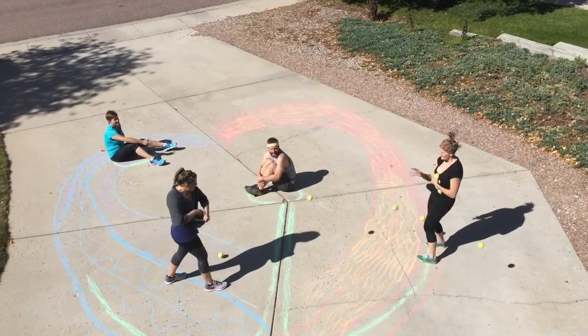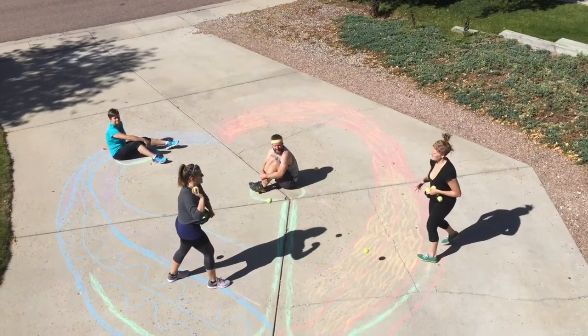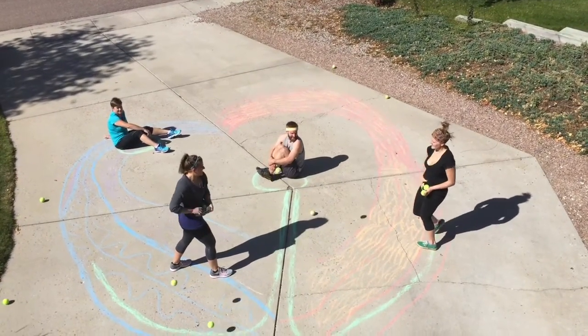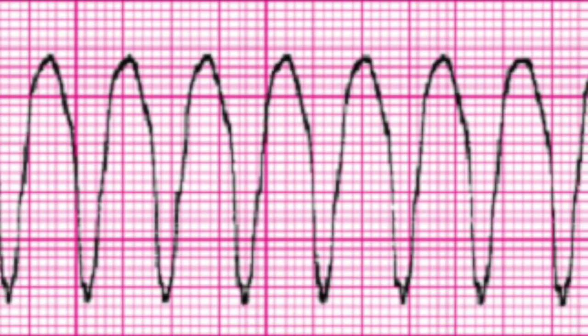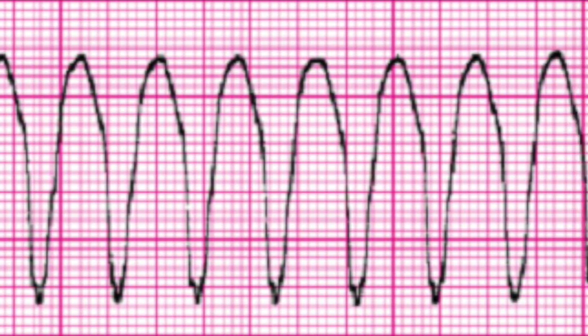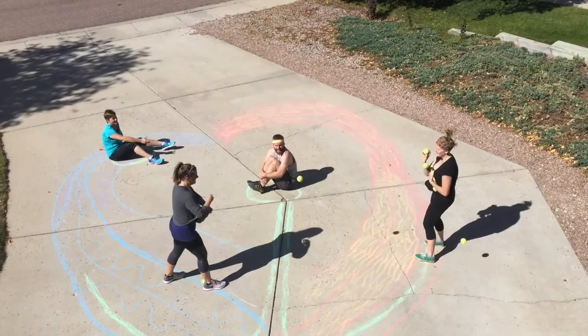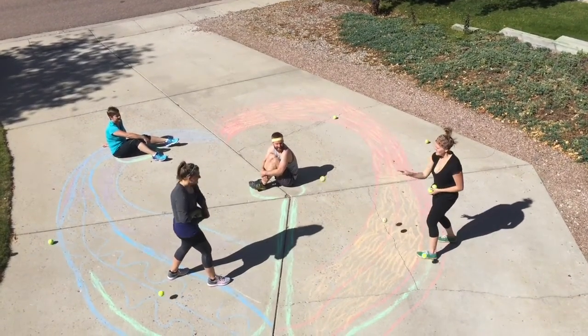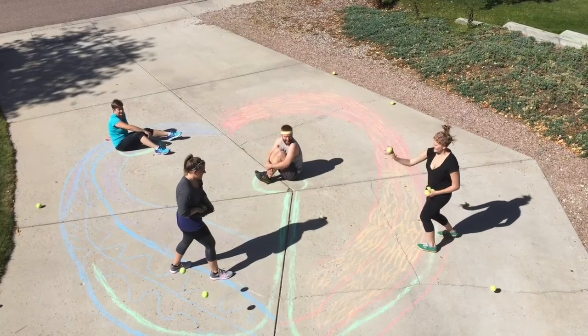So VTAC's a fatal rhythm. The ventricles take over and you can see them throwing back and forth electricity in a negative feedback loop. This means the electrical conduction is going to look wide and weird because it's not going through the normal pathways. Electricity is passing through the heart, but the ventricles aren't pumping because the electricity is just freaking out. I mean, look at those Purkinjes.